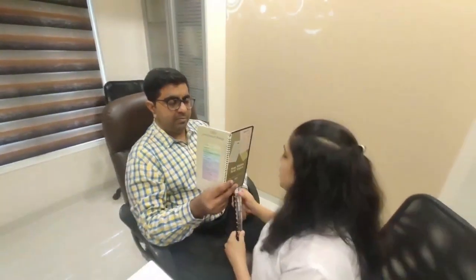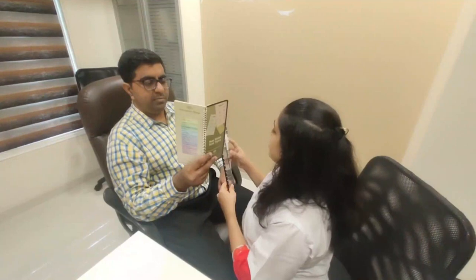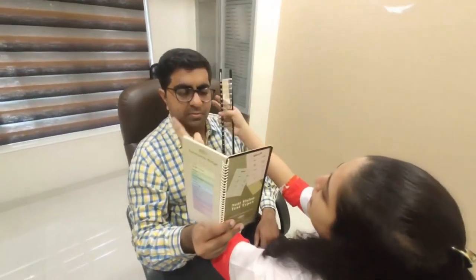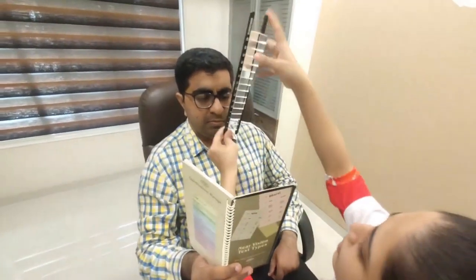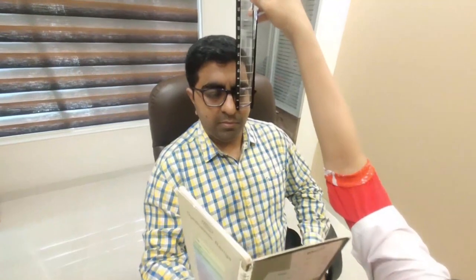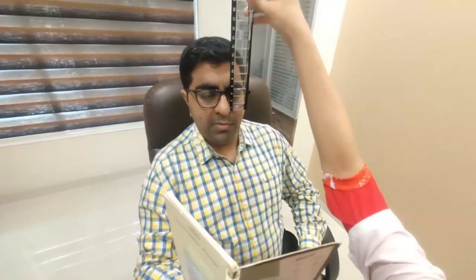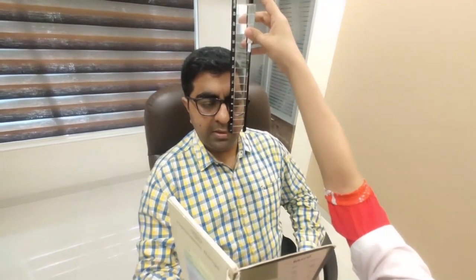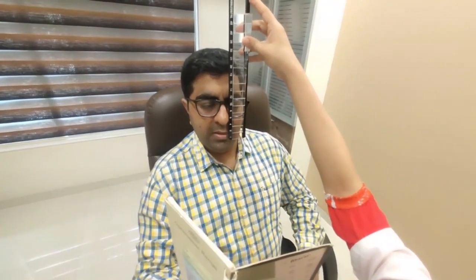Yes. Okay. Next, we will do the positive fusional Vergence test, where the base will be put away from the nose, that is outward, base out. Okay. Please look here at the print. Is it clear? Yes. Clear and single? Yes. Clear and single? Yes.